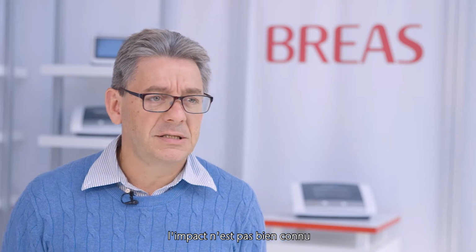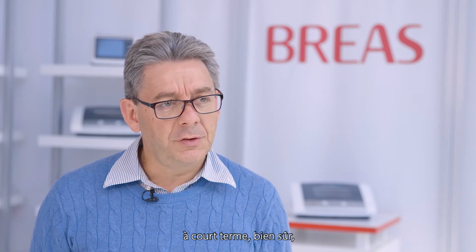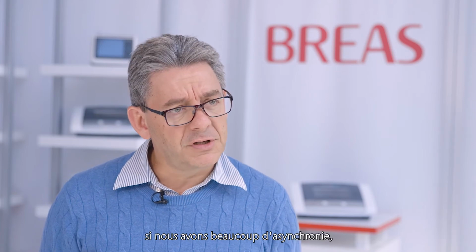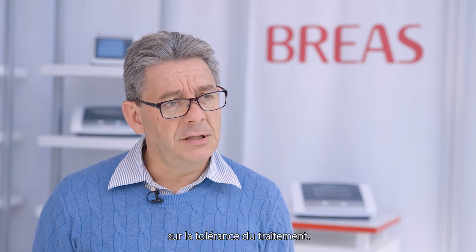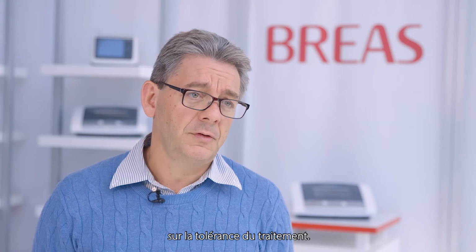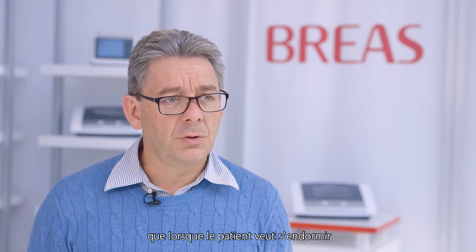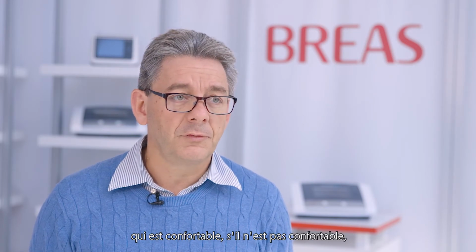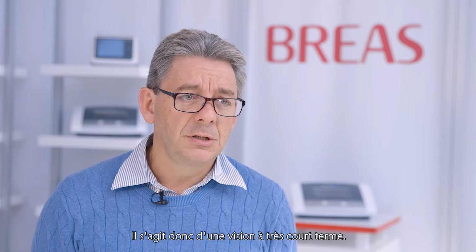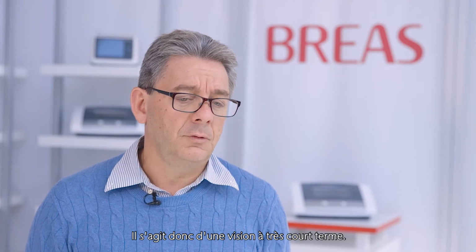Well, the impact is not well understood. On the short term, of course, if we have a lot of asynchrony, the patient can be very uncomfortable, and then it impacts the tolerance of the treatment. So the most important is that when the patient wants to fall asleep with his NIV ventilator, it's comfortable. If it's not comfortable, the patient will not tolerate it. So this is a very short-term view.